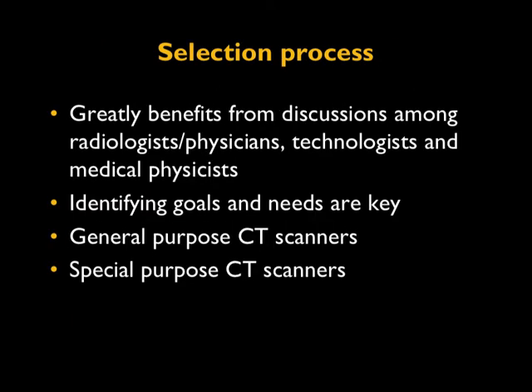The selection process greatly benefits from discussions among radiologists, physicians, technologists, and medical physicists. I consider this a teamwork, so that a clinic can have a proper process in selecting the right equipment for their particular need.